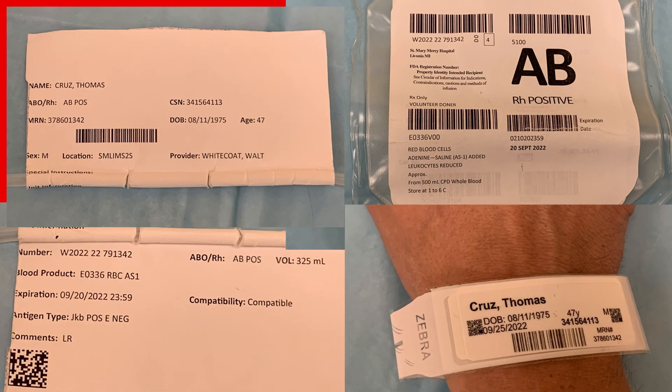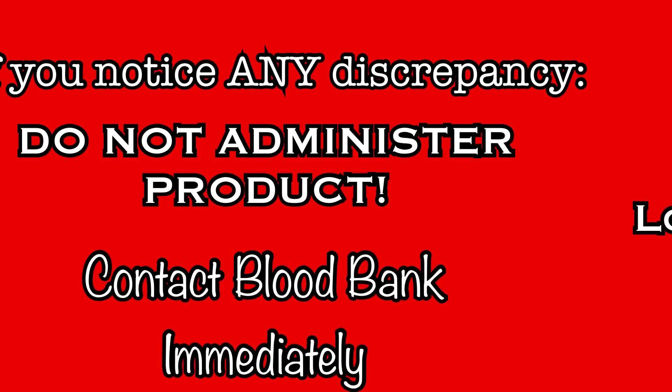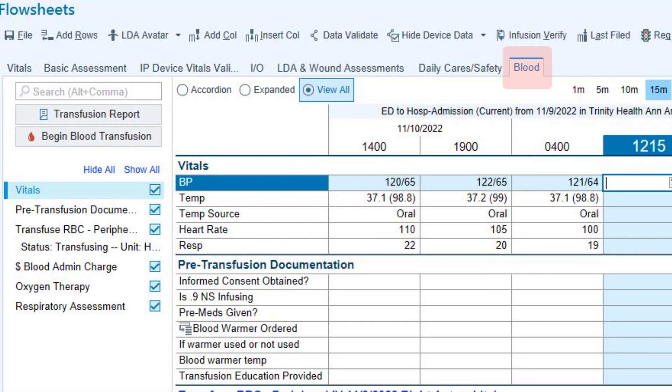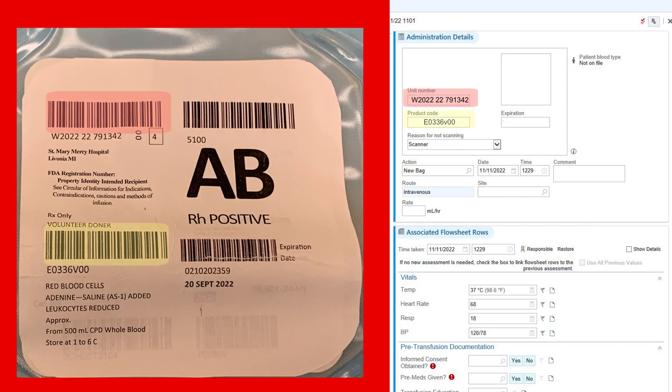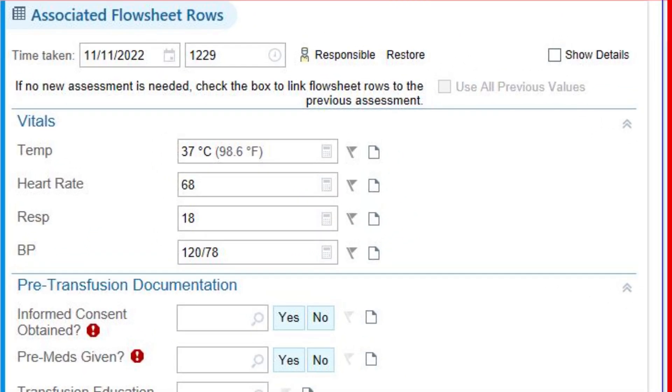If all information matches, the product is safe to administer. If there are any discrepancies, do not administer this product, but instead contact blood bank immediately. If the verification was successful, log into EPIC to finish the process. Go to the blood flow sheet and click on Begin Blood Transfusion. A prompt appears to link the product to a specific IV — choose the line that will be used for this transfusion. Then scan the unit number, product code, blood type, and expiration date barcodes. If pre-vitals were charted within the last 30 minutes, they should auto-populate in the vitals field. If they do not populate, enter them here.